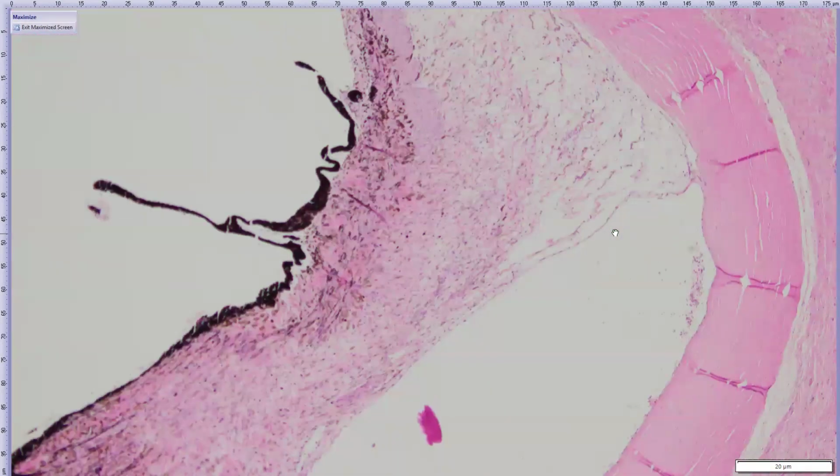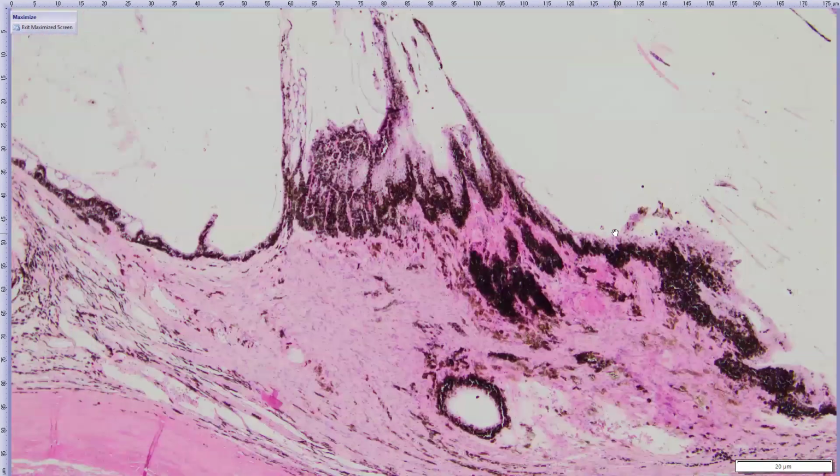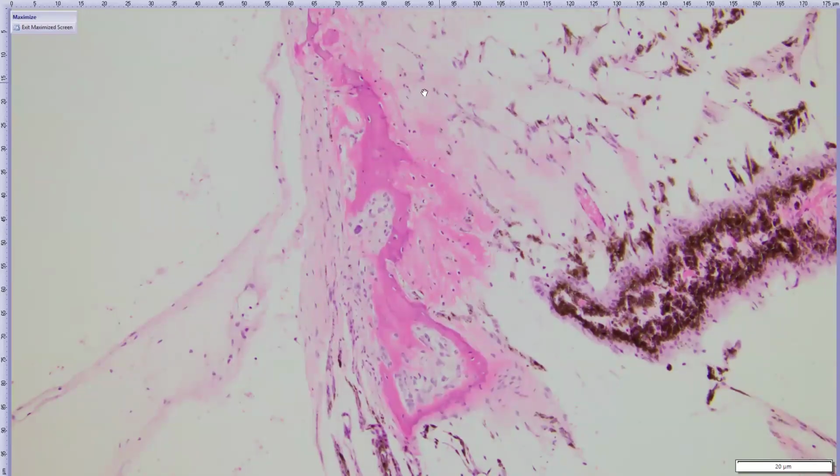All right. So we have a very distorted uveal tissue as we continue over this way. So here we're at our ciliary body pars plicata. And lining that, we do have this more collagenous tissue, so a little membrane over it. And embedded within that, there's also this woven bone. We can go to other areas, forming these amorphous structures.